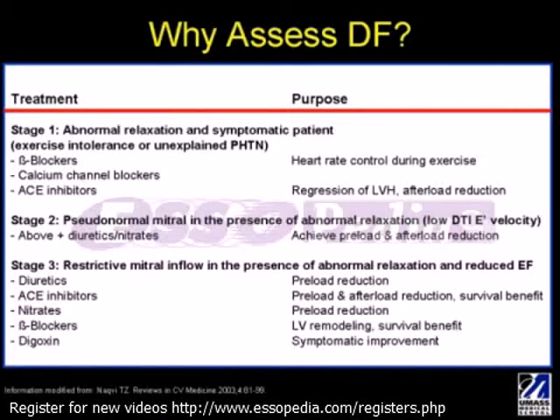However, both stage 2 pseudonormalization and stage 3 restricted filling may include additional medications such as diuretics, nitrates, and digoxin, all of which help with control of preload, afterload, improved survival benefit, and left ventricular remodeling. Given that medical therapy may be tailored in such a way, it is obviously imperative for the sonographer to correctly obtain cardiac measurements to determine the extent of diastolic function.